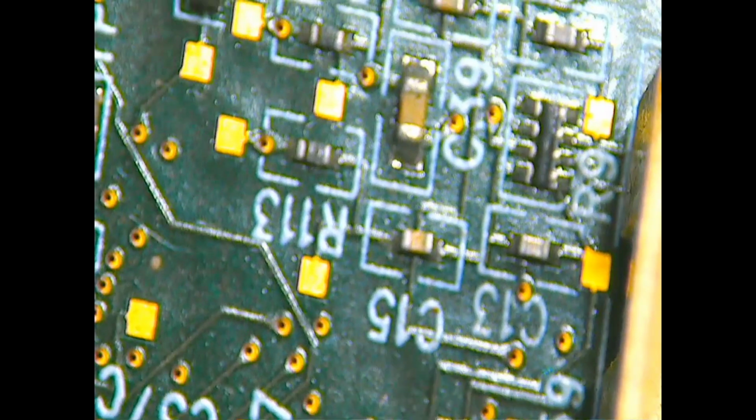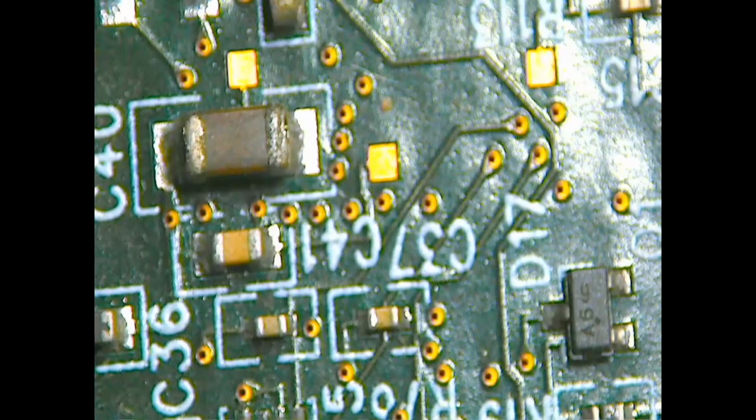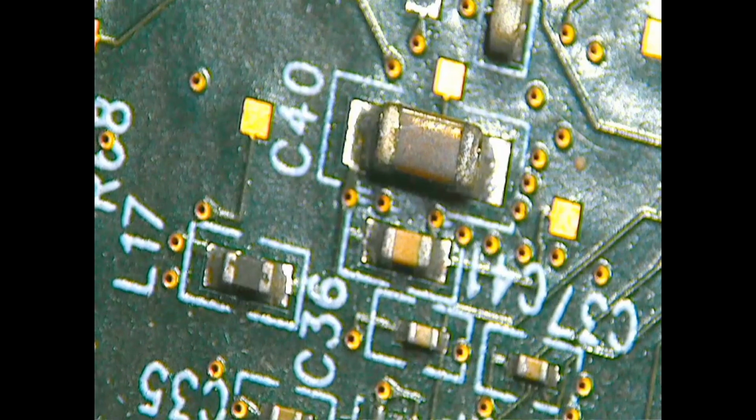This one is not good. Actually, the board is half shorted, so we should find which component makes that issue. Because sometimes, if the capacitor is fully shorted, it will show around 0.3 to 0.6, but here we can see 17.2 ohms, which is not good. In a fully shorted machine you can inject the voltage and see the heating spot, and we can get a conclusion of which component is getting bad.